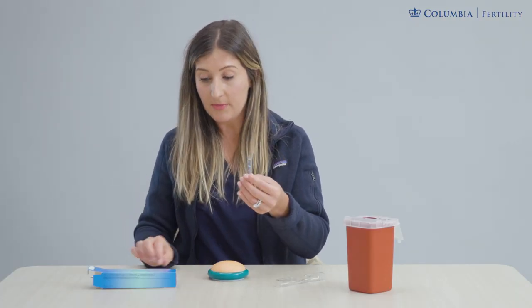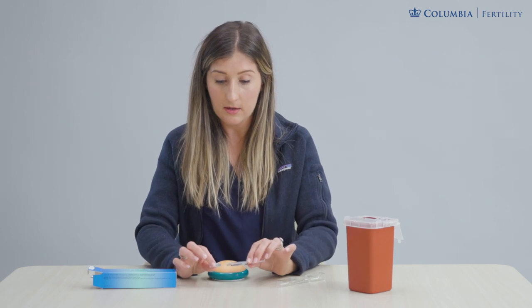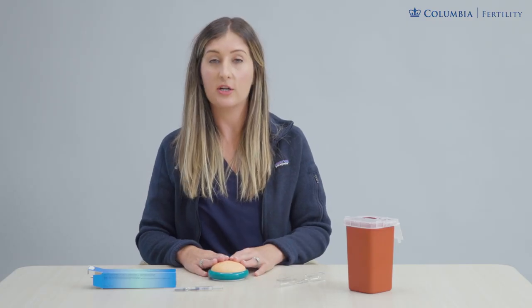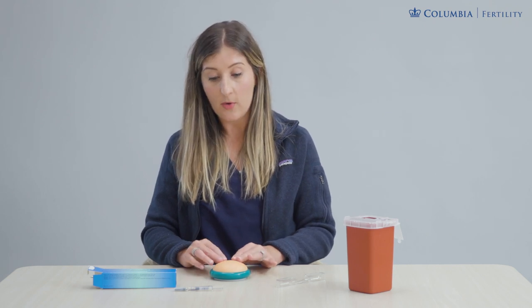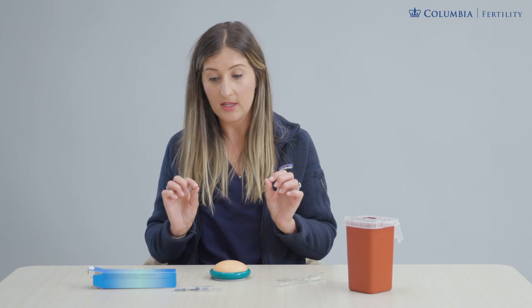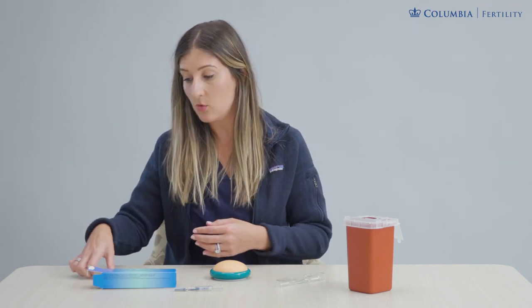That's your prep. Carefully put the needle back into the cap and set it to the side while prepping your injection site. We're going to be going into that same abdominal site — the U-shaped area of skin around the belly button — making sure our hands are clean and washed.